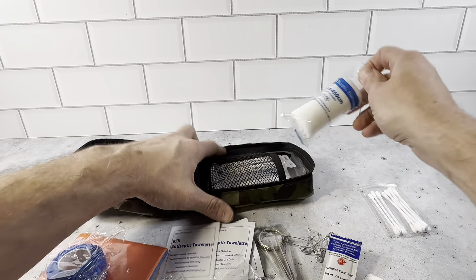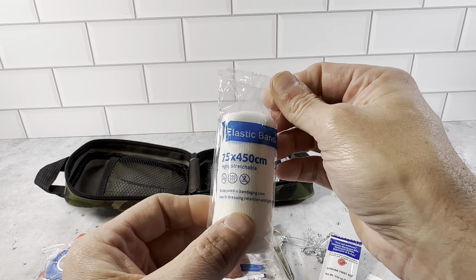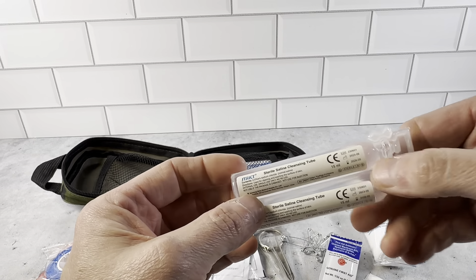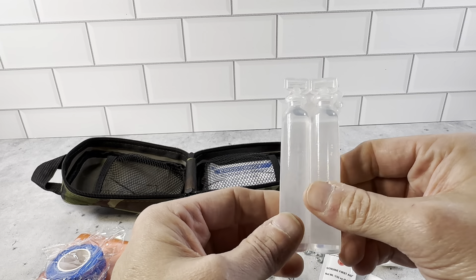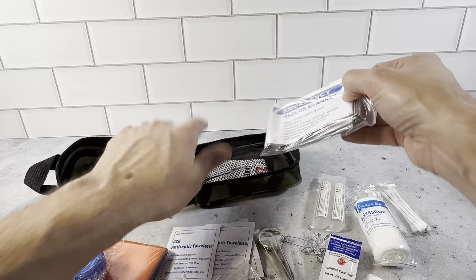Let's open up this side and see what we have. We have an elastic bandage — this is 7.5 by 450 cm. Sterile saline cleansing tube. You get a tube of this right here. This is really great, very inclusive. You have everything you can think of here.